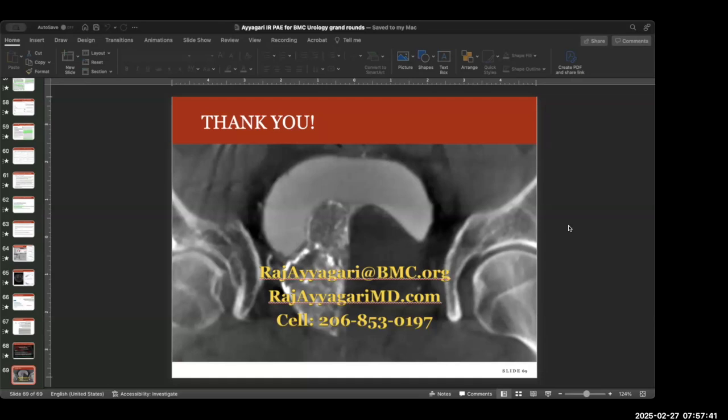Hello, I have a question. What do you do with patients? For example, you got a 75-year-old patient with all possible cardiovascular risk factors, diabetic, smoker. He had already had an aortic coronary bypass. He has had erectile dysfunction for long years. So in those cases, don't you do any CTA upfront? I think it depends on your comfort level with pelvic angiography.